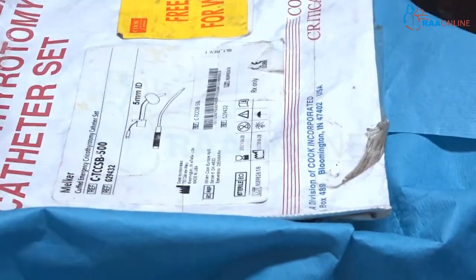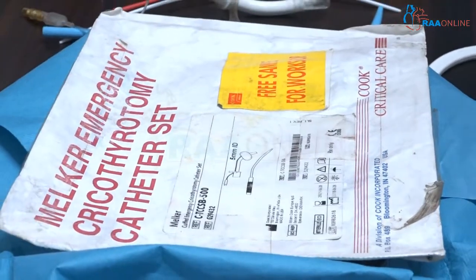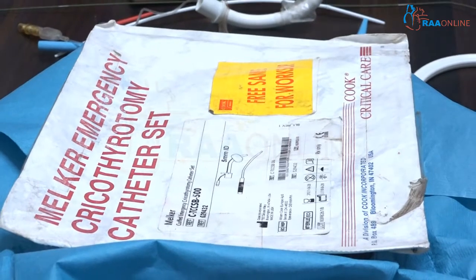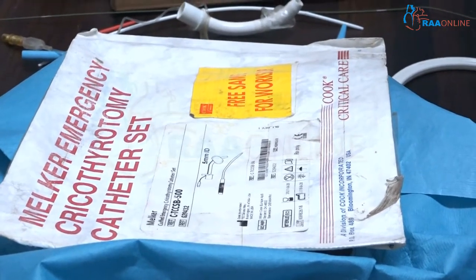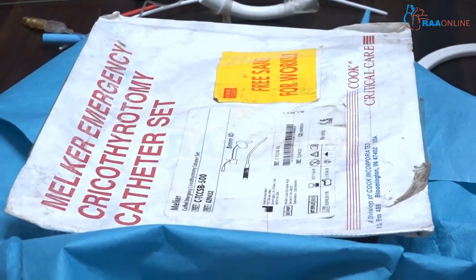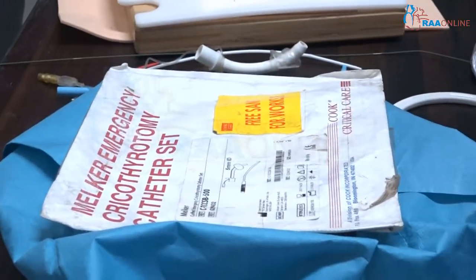This is a very emergent situation, we should not waste time, so everything is pre-fixed. The obturator is inside the 5mm cricothyroidomy tube, and there is a guidewire, a needle, and a syringe. We are supposed to palpate the cricothyroid membrane.